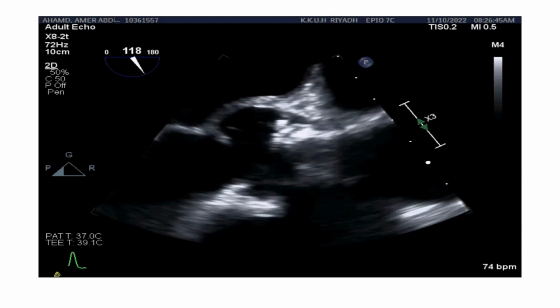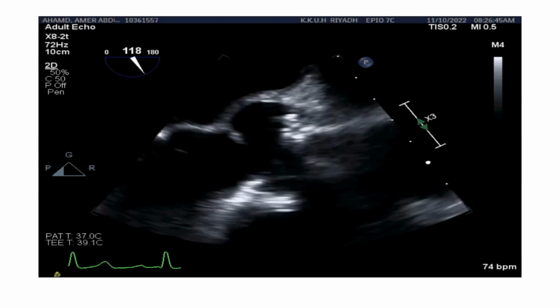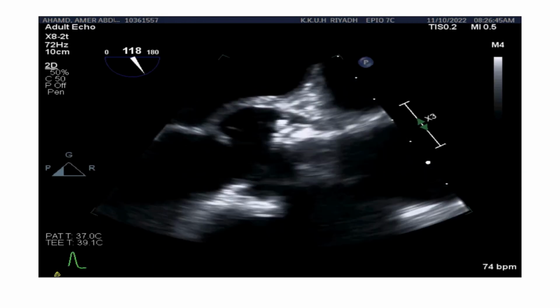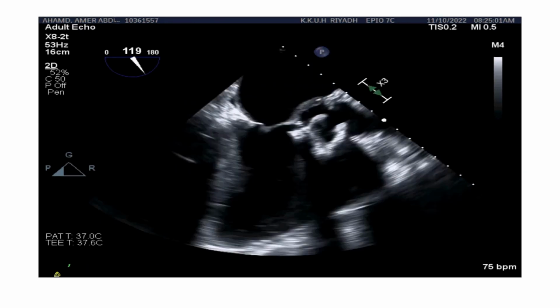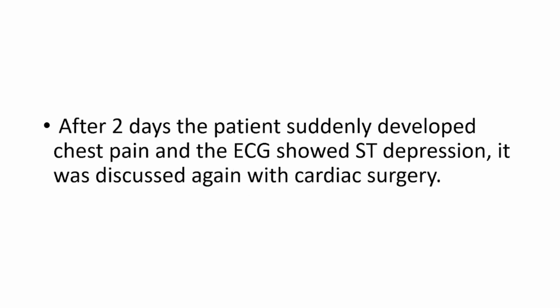This patient is alert, conscious, and goes over everything. We cannot ignore this. We have to take him for surgery. Then finally, one of the surgeons accepted to go for high-risk surgery. TE repeated. This is the TE. He took him after high-risk surgery, but he said he's scared of bleeding in the brain or in the GI because of hepatic Child C.